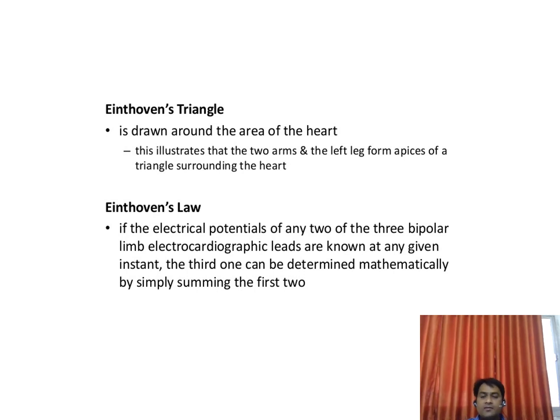In short, the potential at lead 2 is equal to the potential at lead 1 plus the potential at lead 3.